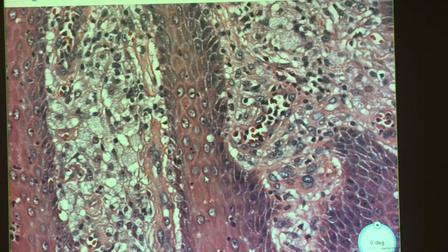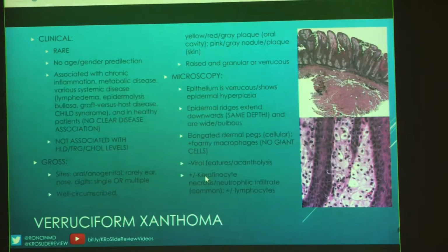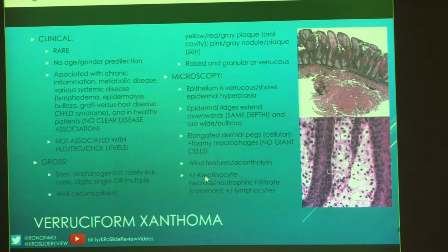Verruciform. Verrucous-like, yeah, verruciform. Verruciform xanthoma, so that's what this is. These are very rare, so you don't have to remember any age or gender, which is quite nice, even though if someone asked you for most of these lesions, again, they're male, but not for this one.